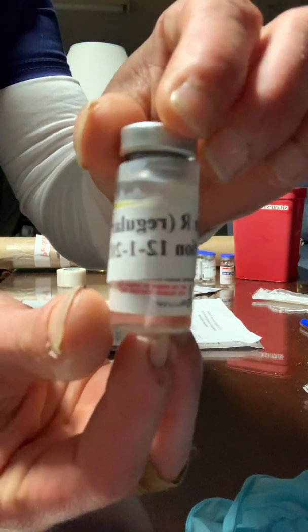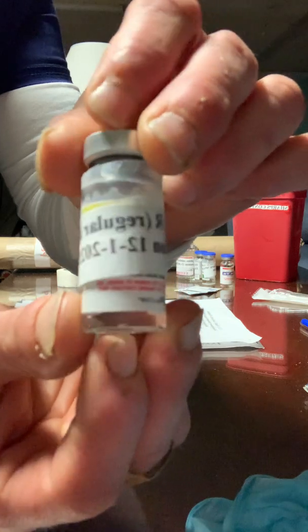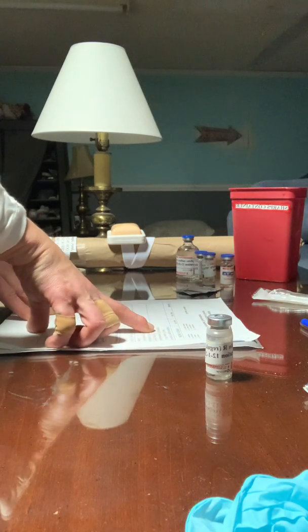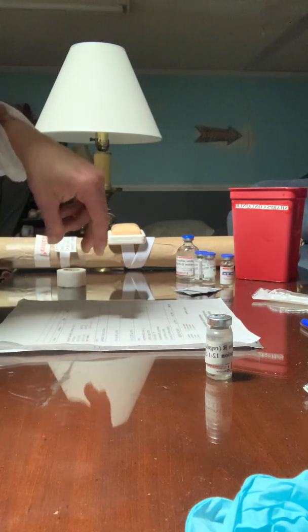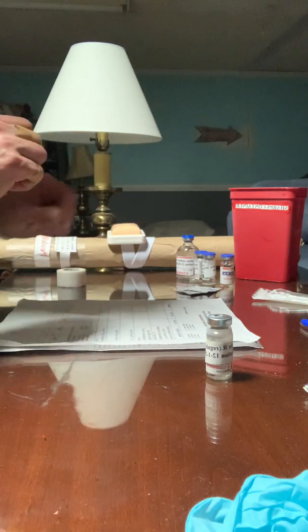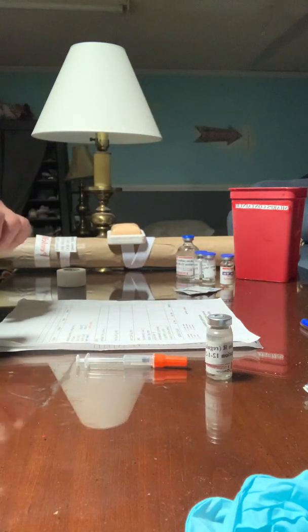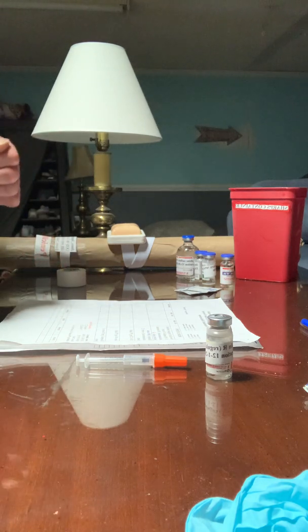Novolin R insulin, 12/25. And he is to receive this subcutaneously 30 minutes before meals, and it is 30 minutes before meals, and he has not had this medication within the last several hours, so it is safe for me to prepare. He is getting this subcutaneously, so I have chosen a good subcutaneous needle. So we have Novolin R, 10 units, 30 minutes before meals.